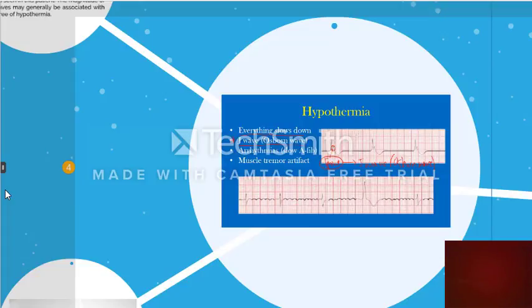In addition, various arrhythmias may occur in hypothermia. The most common one is a slow AFib. The last EKG change you may see is a muscle tremor artifact from the patient shivering because he or she is so cold, and we see that here in this bottom rhythm strip. You can see these waves going up. These are the artifact from the patient shivering because they're so cold.